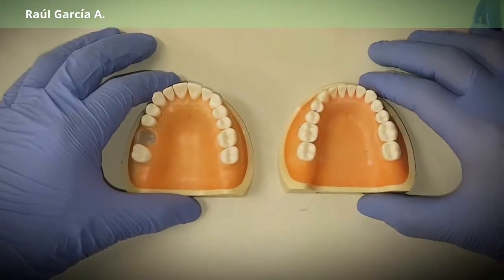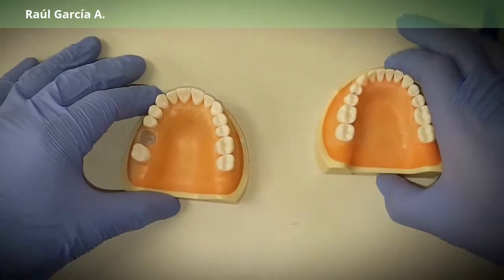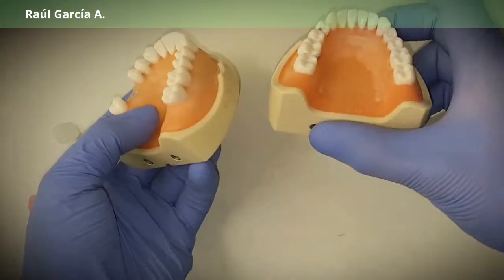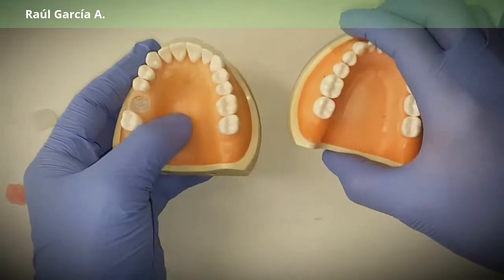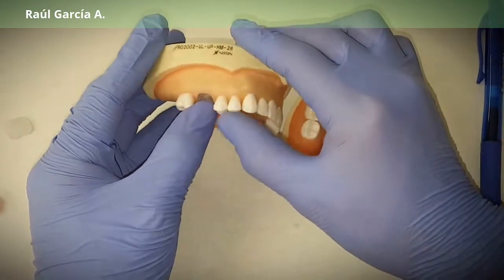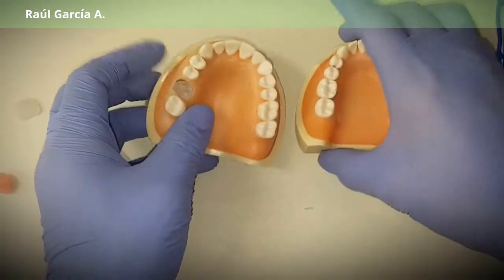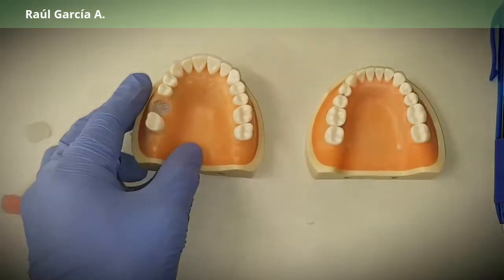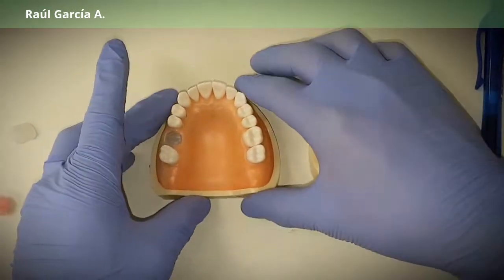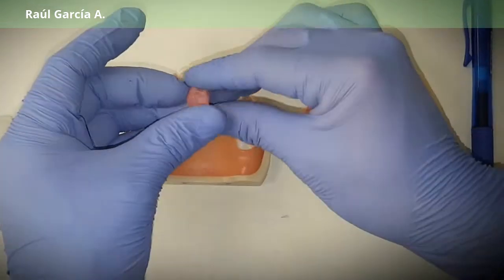In this video I'm going to show you your options to do your temps. These are the preoperative models — you saw your patient and you plan that you want to do a bridge from 15 to 17. So what are your options? You have your preoperative models and then the first option is you can do a wax-up.